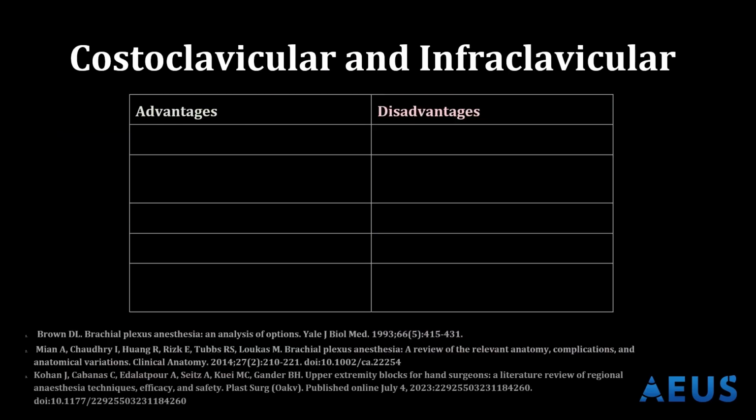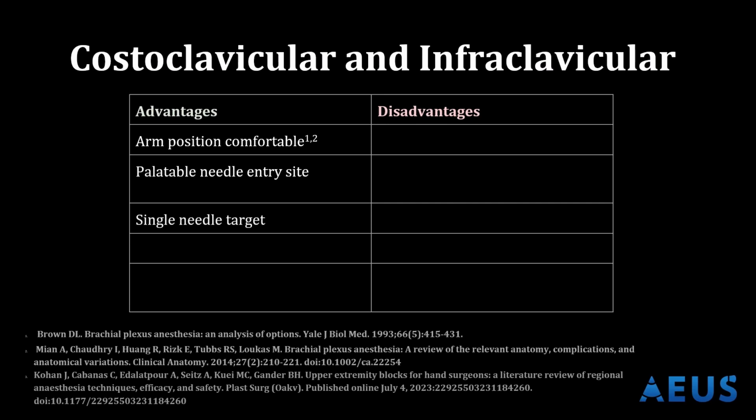These two blocks share some advantages, first of which is that the arm can remain in a comfortable position. Secondly, the needle entry site is palatable, not located in the neck. And finally, there's a single needle target, so there's no need to redirect the needle. They also share disadvantages though.